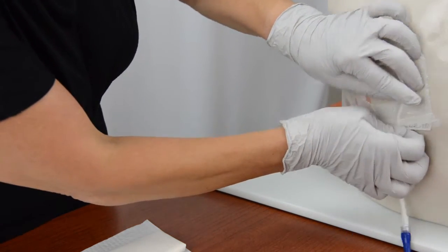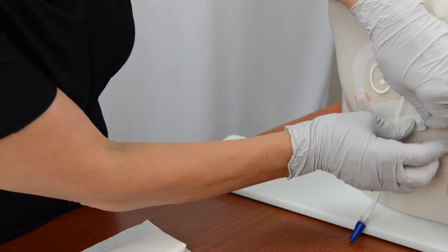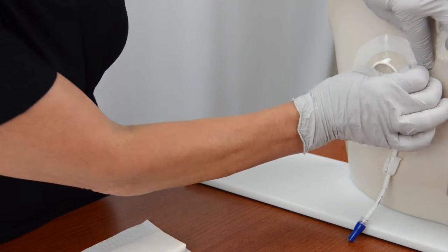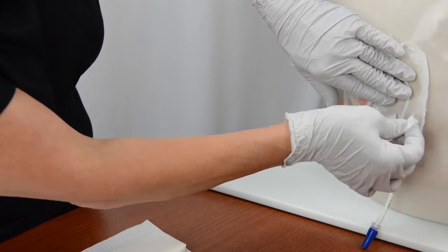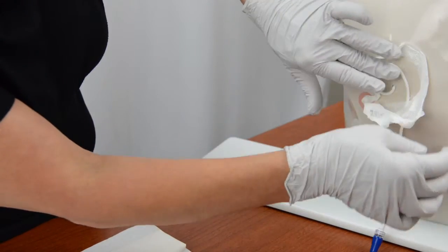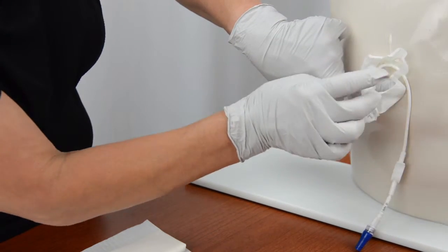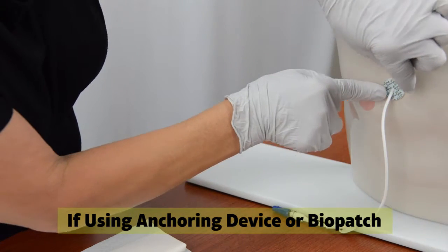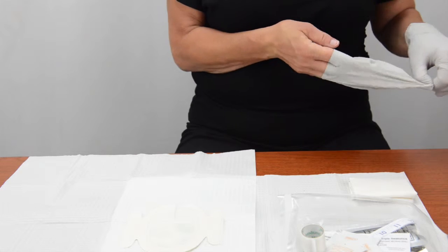Loosen the edges of the old bandage and gently pull the edges toward the catheter entrance site from all directions. Put your thumb or forefinger over the catheter entrance site to hold the catheter in place while you peel off the old bandage. Do not pull on the catheter while removing the bandage. Put the old bandage into the trash. Remove the anchoring device and biopatch from the IV catheter if they are in place.